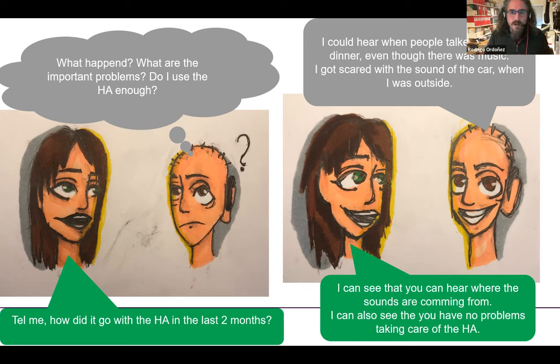I think one of the things that we are not so focused on here is what things are good experiences. Both Nadia and Josefina in this try to find out when things don't work, but in terms of hearing rehabilitation, it is just as important to find out what works, right? Because we might think that, oh, a bit more of this here and there will change things to what I think the experience should be, but we should be able to rely on what people think. Well, this is great, don't mess with it. You know, I like the way things are going here, or this is actually an empowering experience for me. So we need to keep that in mind, and not only try to fix problems, but also acknowledge when things are going well, both for our sake and the sake of the subjects. Sorry, patients. Keep messing that up.